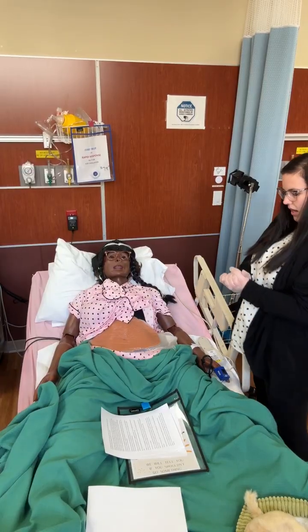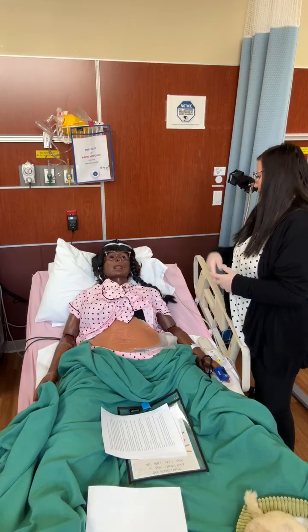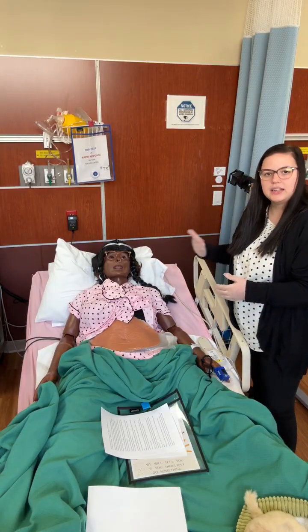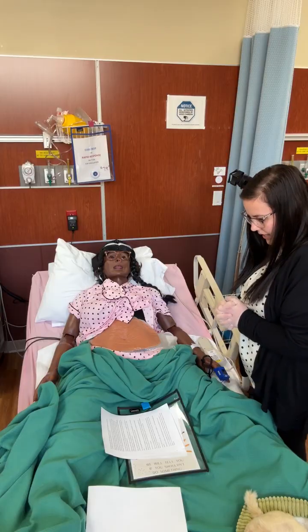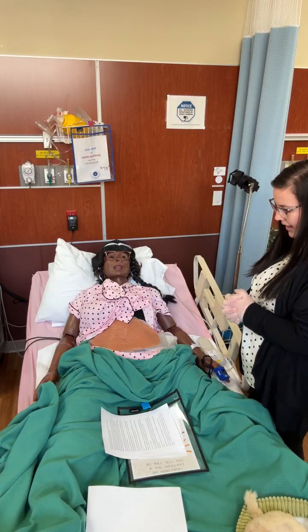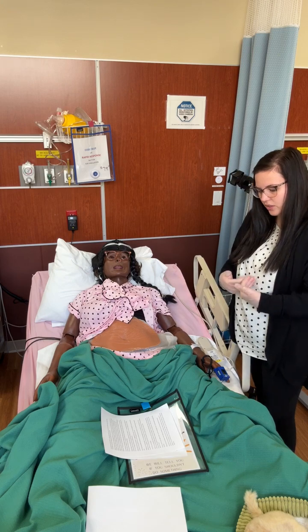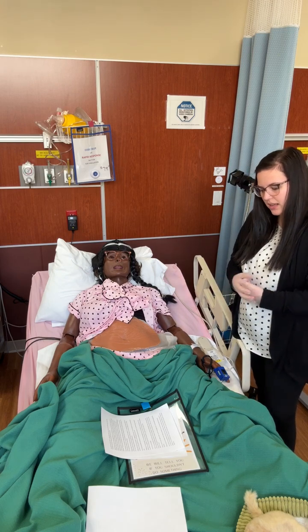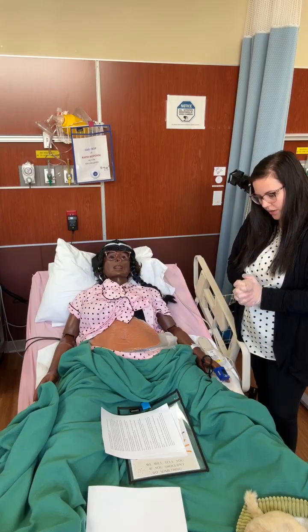Please talk to your simulator when you're speaking, like you're speaking to a patient. So tell her what you're doing and try to keep this as real life as possible. It is important to pay attention to what she says because as sim staff, we're talking as the patient, trying to give you cues and prompts. It's part of a script. So just make sure you're doing that.